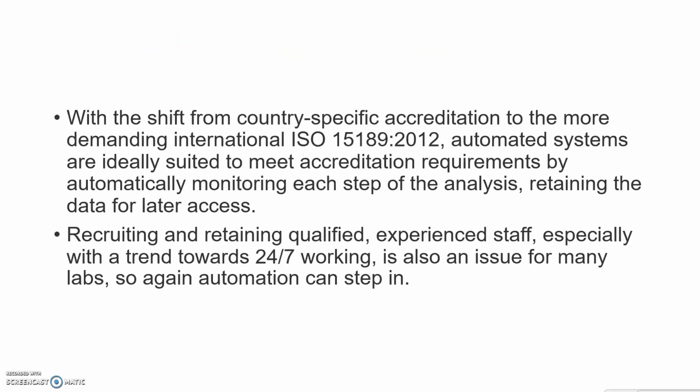With the shift from country-specific accreditation to the more demanding international ISO 15189:2012, automated systems are ideally suited to meet the accreditation requirements by automatically monitoring each step of analysis and retaining the data for later access. Recruiting and retaining qualified, experienced staff, especially with a trend towards 24/7 working, is also an issue for many labs, so again automation can step in.